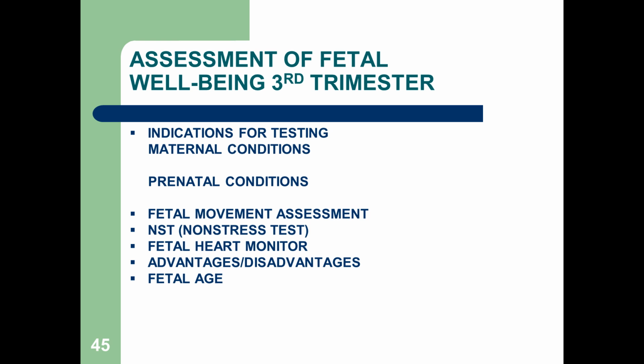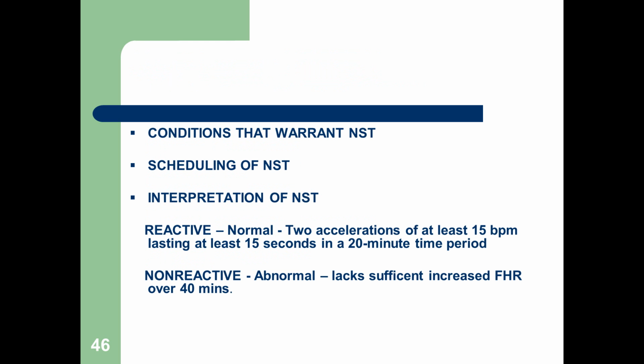If the baby's premature or not quite to 32 weeks, they may not have as much movement, okay? And maybe their heart rate is fluctuating erratically. So, again, to assess for fetal well-being, we're going to put them on a monitor and or do a non-stress test to make certain that the baby is better inside as opposed to outside and vice versa. Okay?